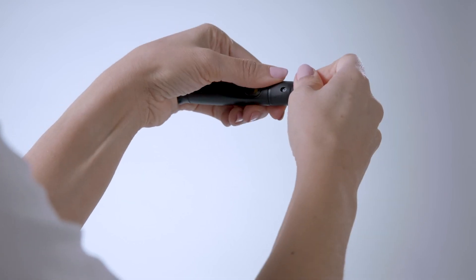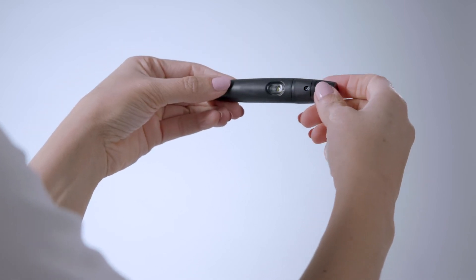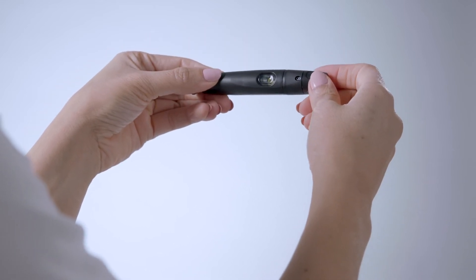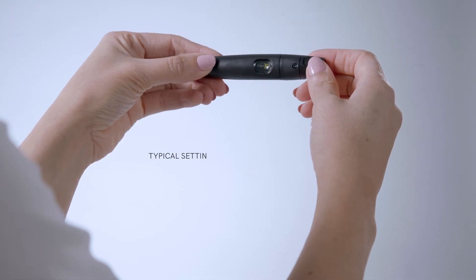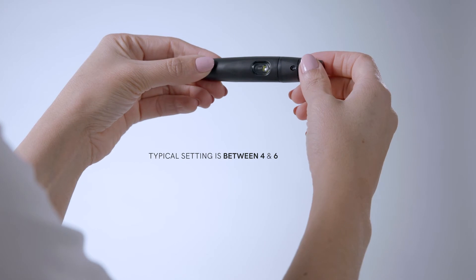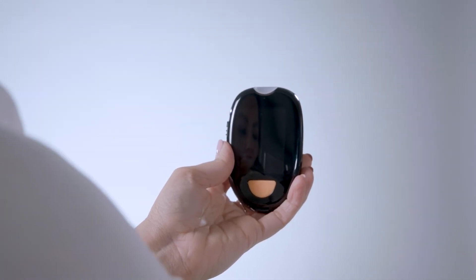Pull the cocking control at the opposite end of the lancing device until it clicks. Note that the button window is now green. Note the numbered settings — adjust as needed depending upon the thickness of your skin. This may take some trial and error, but most people set it between four and six. The higher the number, the deeper the prick.